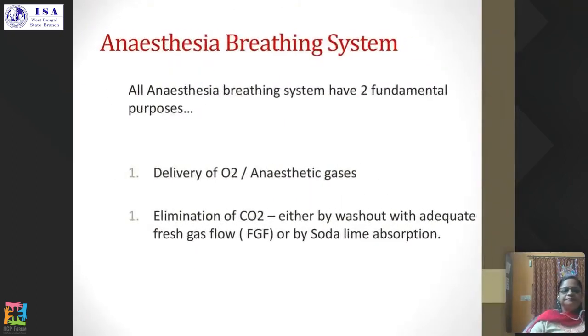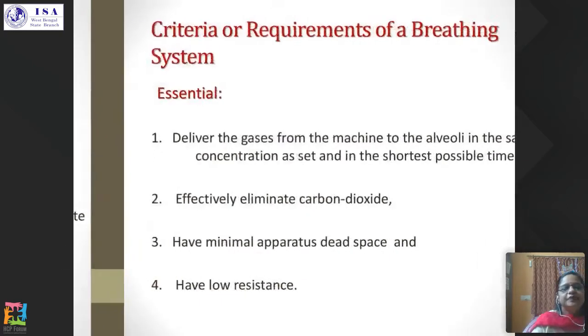Now, all anesthesia breathing systems have two fundamental purposes. These are the delivery of oxygen or the anesthetic gases, and the other is the elimination of the carbon dioxide, either by washout with adequate fresh gas flow or by soda lime absorption.